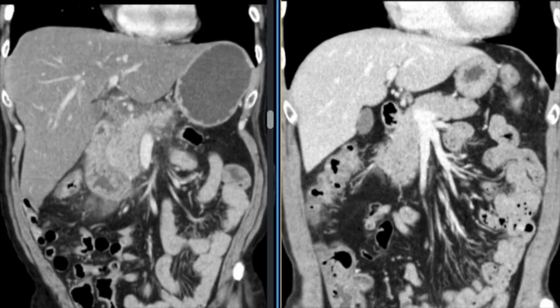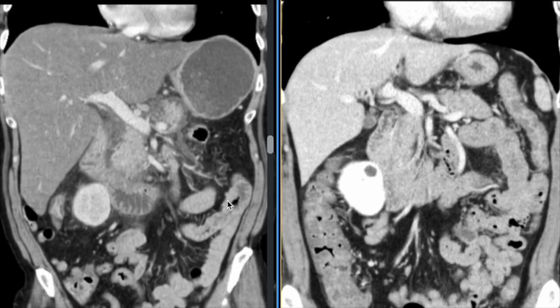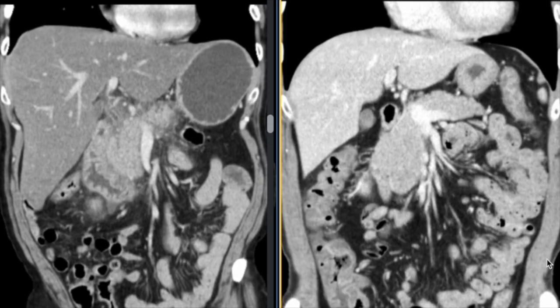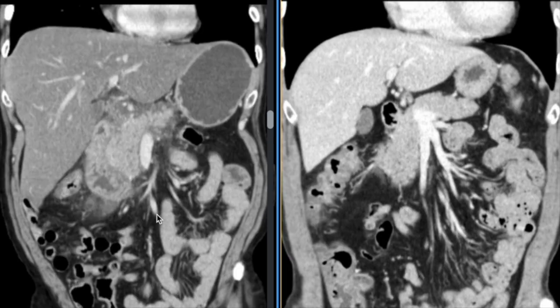Actual management relies on integrating clinical presentation and lab data, so the CT grade isn't absolute. Still, it's a commonly used metric worth knowing. How is that? This is how we interpret imaging for pancreatitis. We'll cover cases with pancreatic necrosis or more severe forms in future sessions and review their imaging findings then.